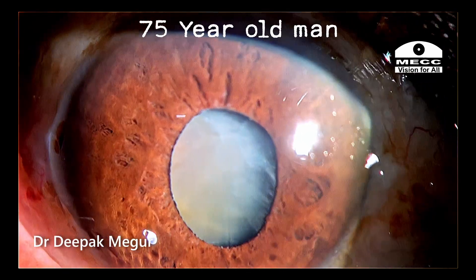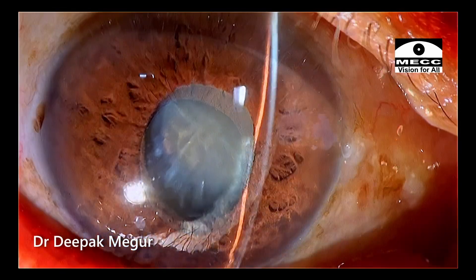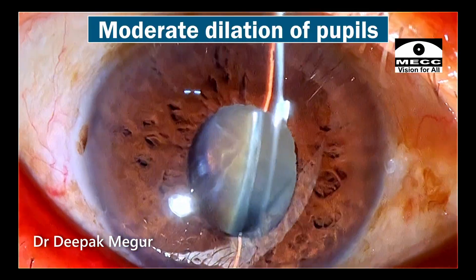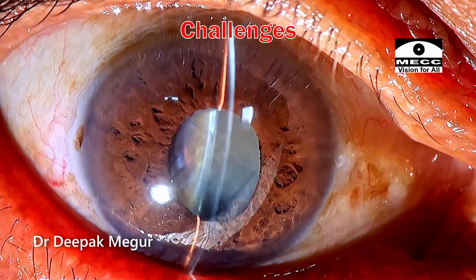This is a 75-year-old gentleman who has a mature white cataract. Along with that, he has pseudo-exfoliation and a moderately dilating pupil. The nucleus appears to be slightly denser, and these are the challenges which I am anticipating.